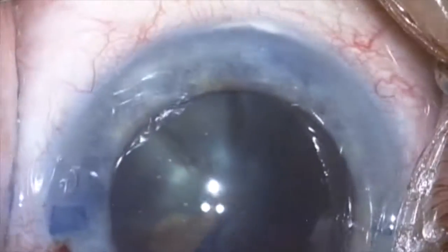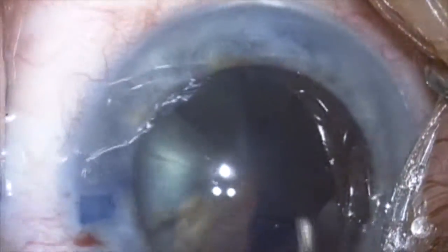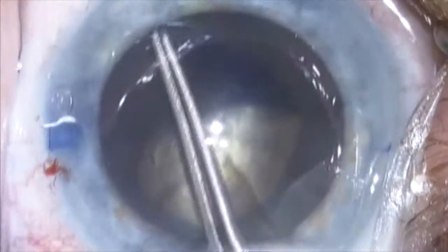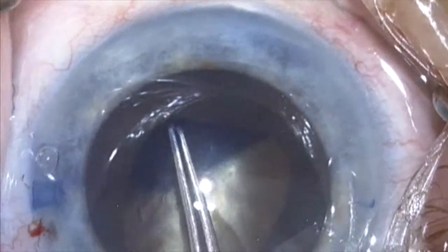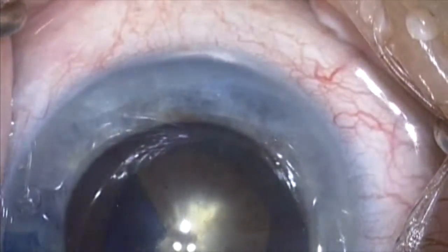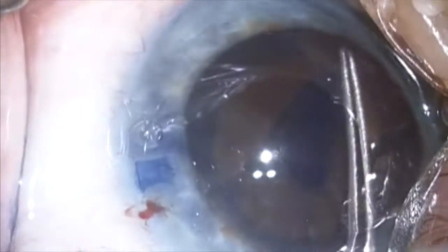A capsulorrhexis has begun using a cystitome to start the tear, and then Utrata forceps is used to complete the tear in a circular fashion. I tried to make this capsulorrhexis an appropriate size so that I would not have difficulty getting the cataract out, but also small enough for optic capture of the lens if needed.